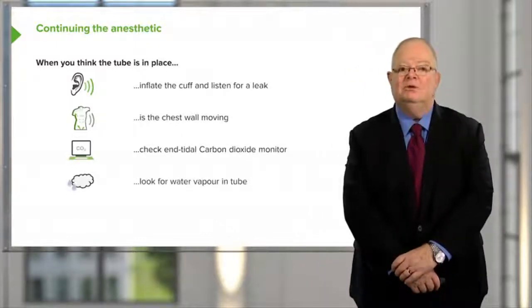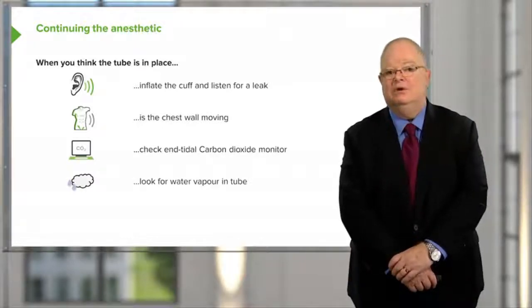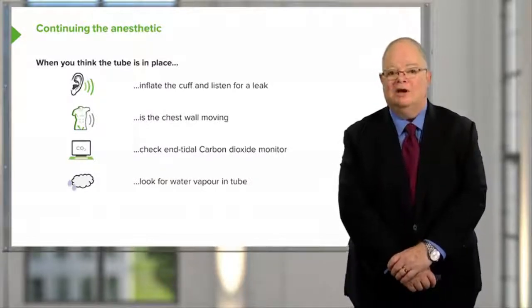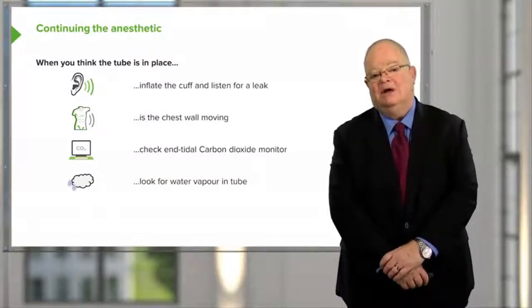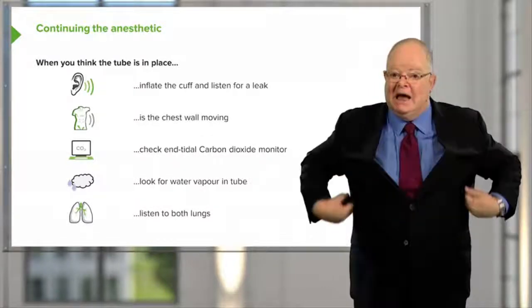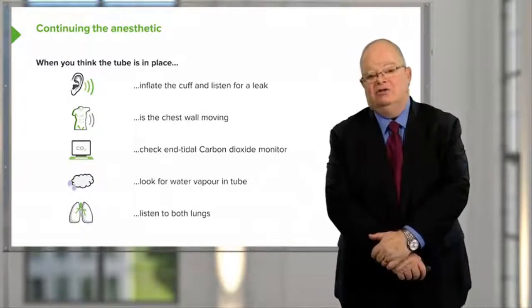Look at the tube. Are you getting condensation of water vapor on the inside of the tube? You won't get that if you're in the esophagus because there's no water vapor to come back from the stomach. So check for those things and then listen to the lungs. Listen bilaterally, listen well out into the axillary area and make sure you've got air entry.